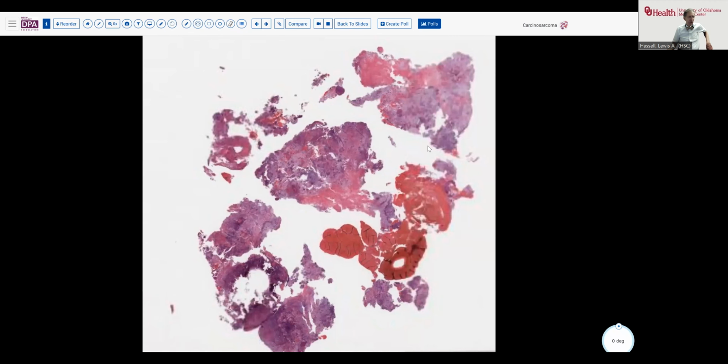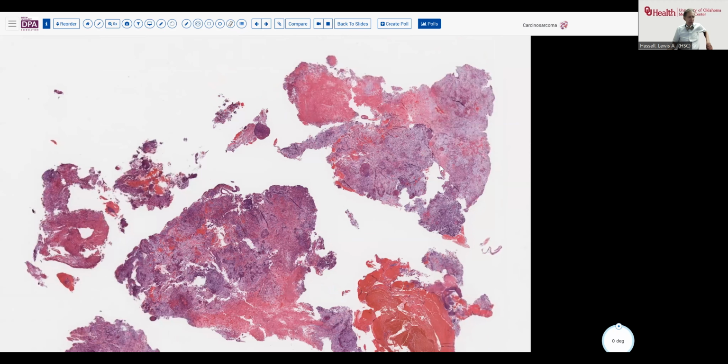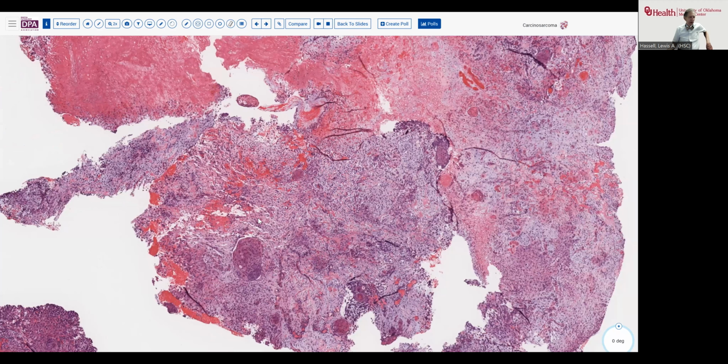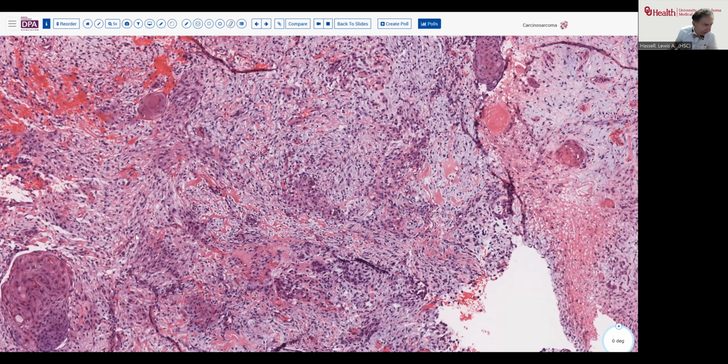This is a patient who had an endometrial carcinoma treated with surgery and probably brachytherapy, but still developed a vaginal lesion a couple of years later, which of course is why they do follow up biopsies. But as we look at this tissue, it looks very different. This does not have a gland-forming basis. This has a lot of loose myxoid spindle-shaped tissue. It has some islands of squamous differentiation. It has some kind of nondescript pink cells here, maybe with a little pearl there.